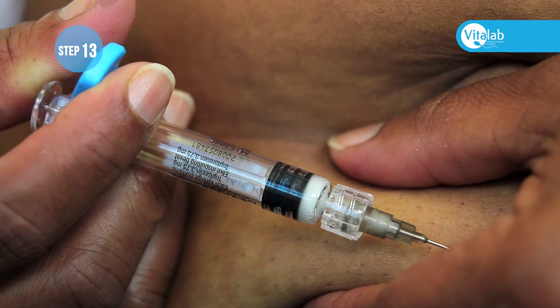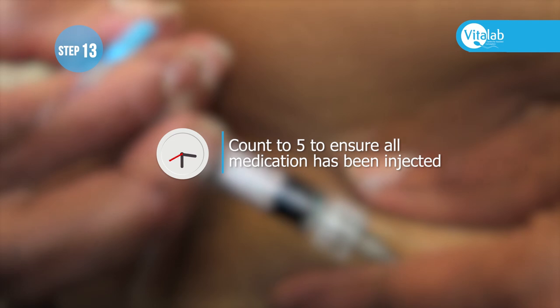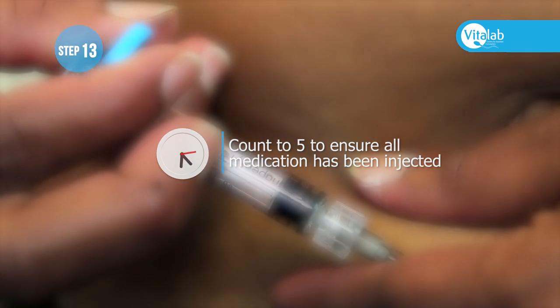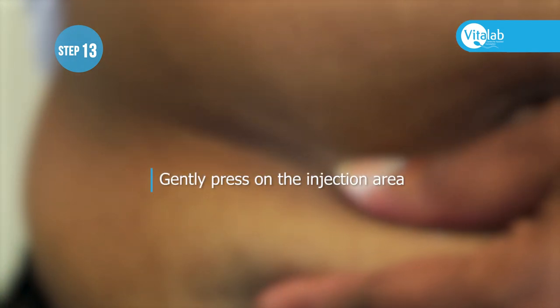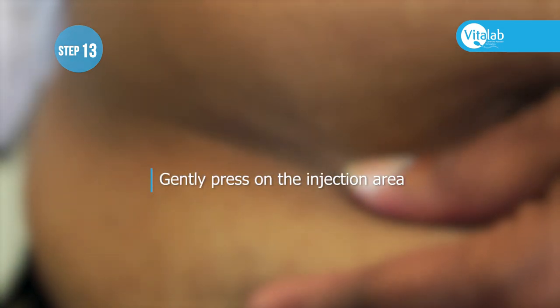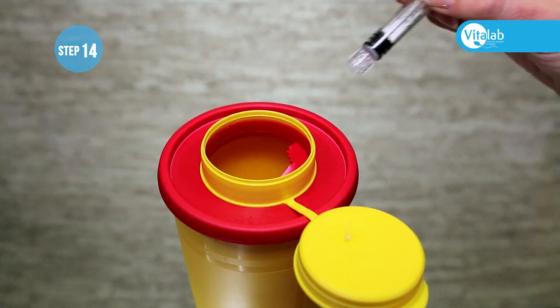Do not pull the needle out immediately — you can count to five to ensure all the medication has been injected. Then pull the needle out gently and press on the injection area. Cover the needle with the cap and discard appropriately into the sharps container.